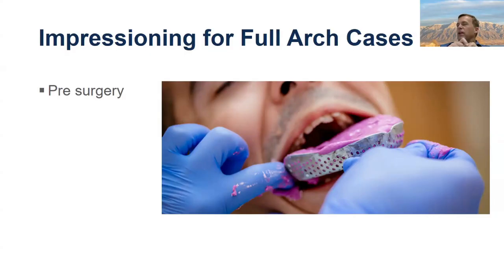And then the second thing you want to think about is bite. You will never have a better opportunity to adjust somebody's bite than the day you deliver all on X day of surgery provisional. So if the person is severely overclosed or not biting in CR, you really want to make sure you catch a nice CR bite at the correct VDO. And then the person will have the healing time where you can do equilibration and get them about where they need to be and then just fine tune it for the final restoration.